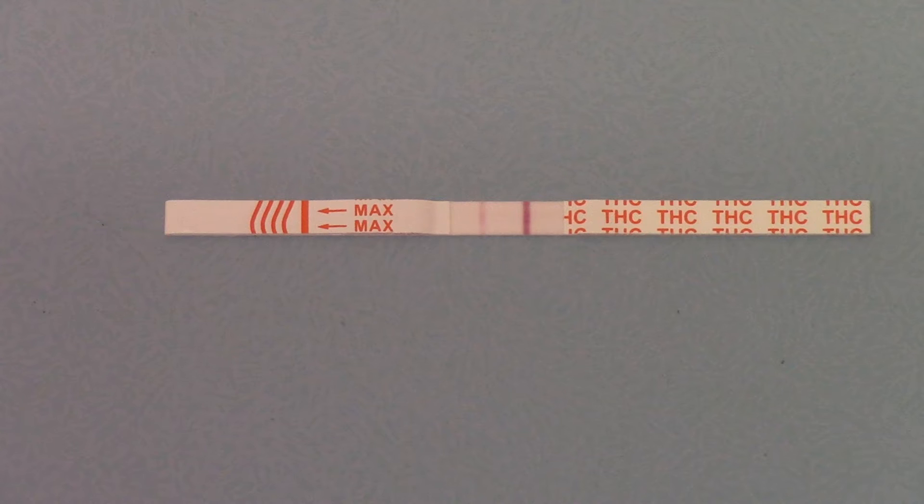Now we're going to talk about the advantage of screening down to 25 nanograms over 50 nanograms. We're constantly asked: if the cutoff for cannabis is determined at 50 nanograms, why screen lower? Because it's an illicit drug — there's no acceptable level. It's not like other tests where you have to determine what a significant level is before you'll consider the result positive.